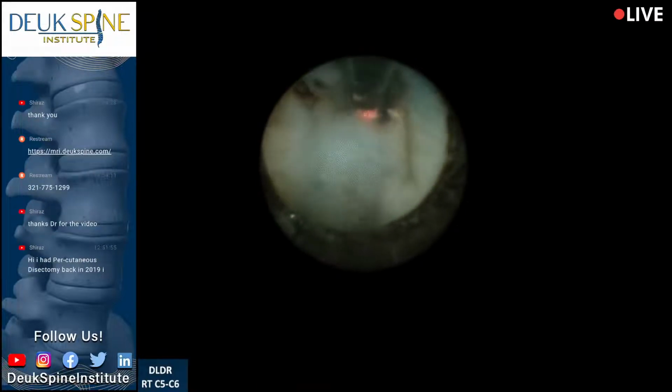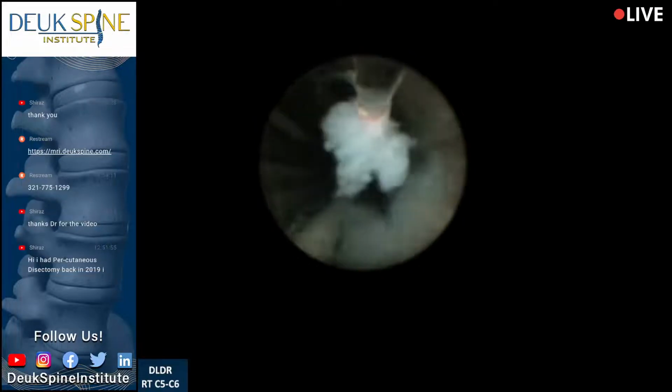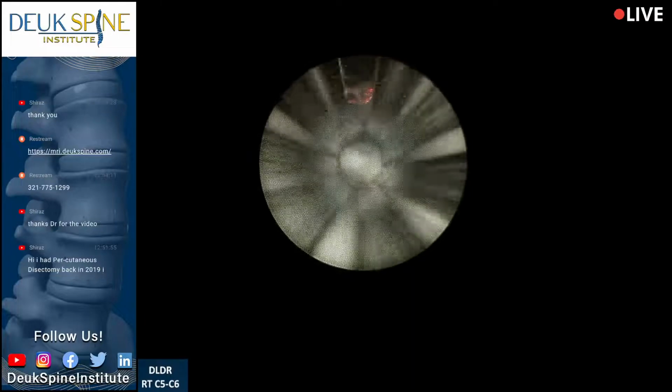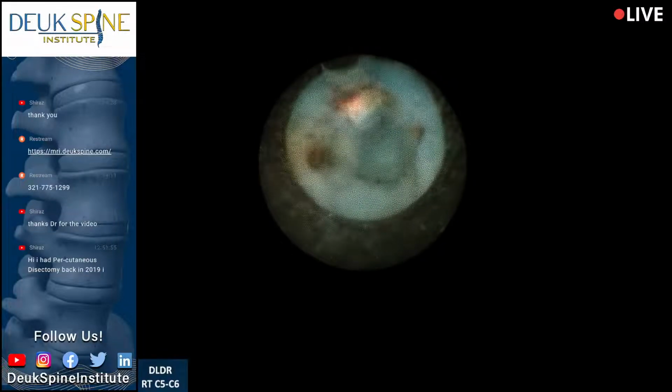Most of her symptoms were left, but she was going to have right-sided symptoms very soon. You can tell. Look at that herniation coming out right there. Oh, baby. Love it. That's a fresher herniation. So I think she was really going to be having right-sided problems very soon, since all this is on the right side. But most of her symptoms are on the left.